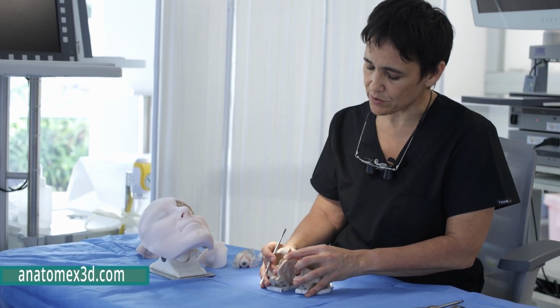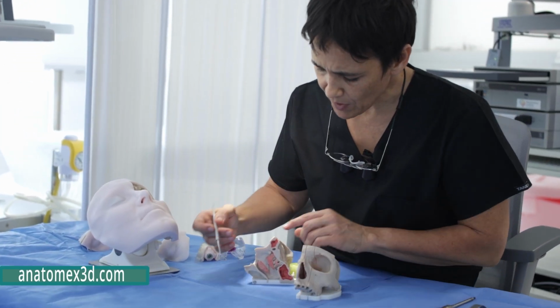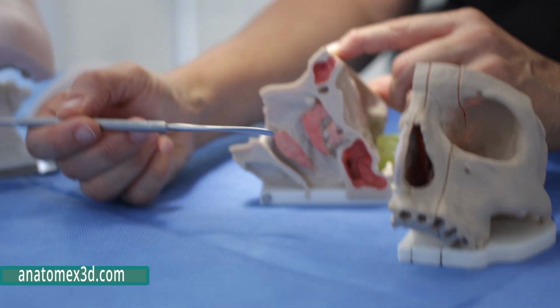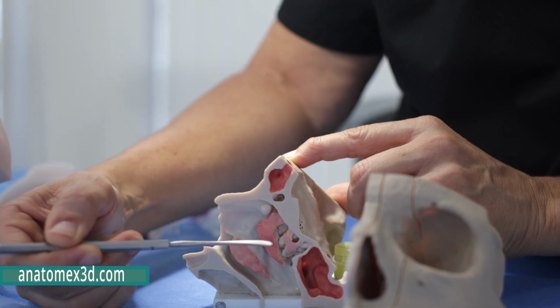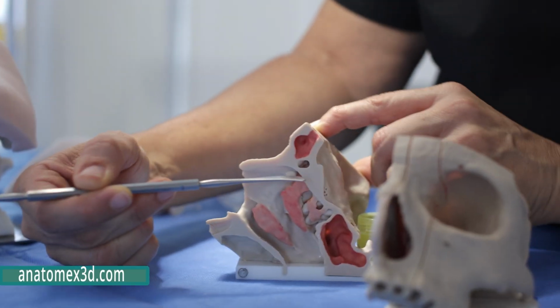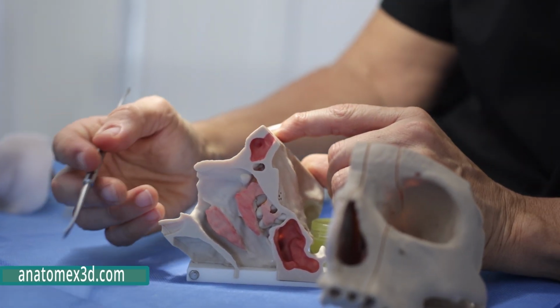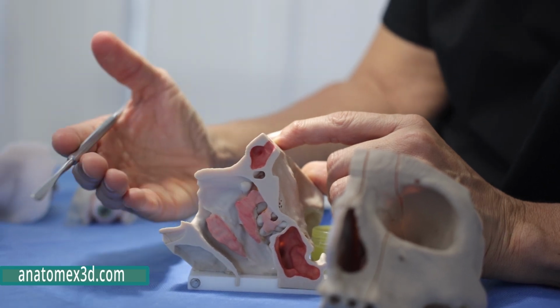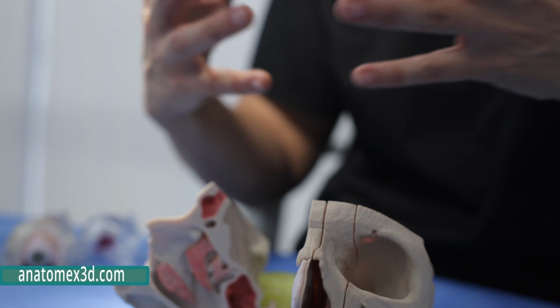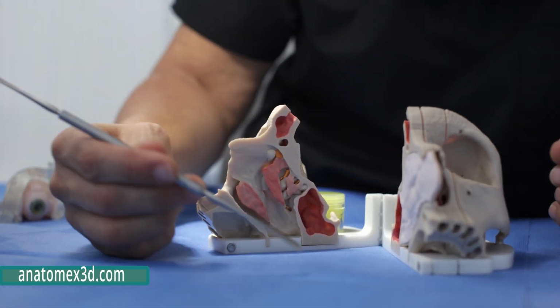Then what is really nice to explain with this model are your nasal turbinates. You have 3 turbinates on each side of your nose: 3 on the right, 3 on the left, what we call an inferior turbinate, a middle turbinate, and a superior turbinate. Sometimes there can also be a supreme turbinate. These turbinates are really important. They're pink in the model to simulate healthy normal nasal mucosa, which shrinks during the day and also congests during the day depending on how the blood fills up in these structures.